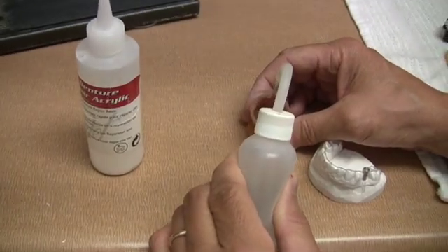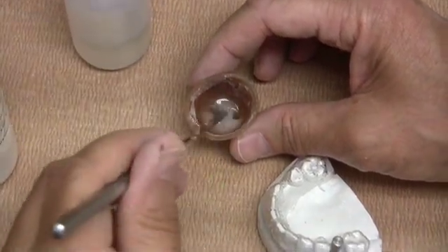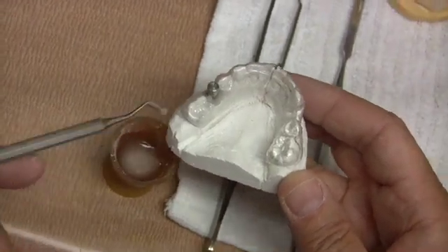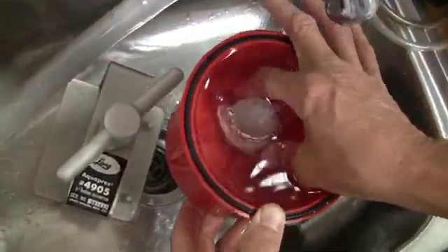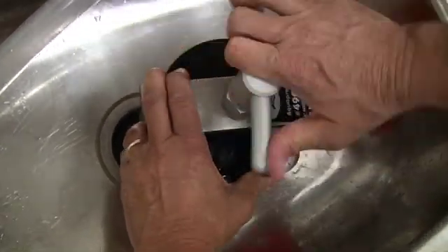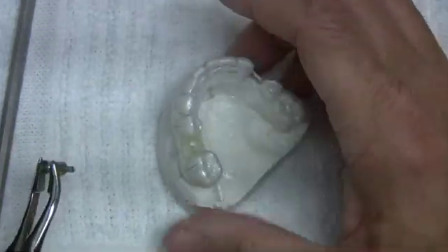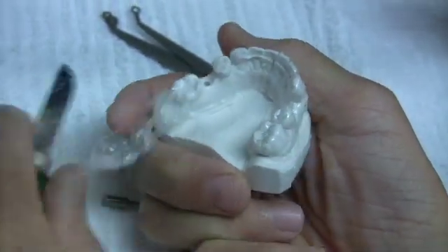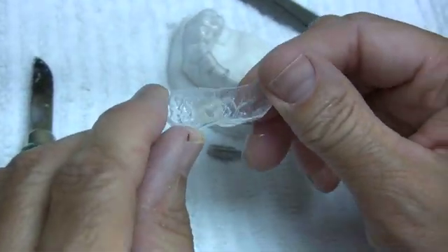Cold-cure acrylic is then mixed and flowed around the stepped pin to form the channel. The acrylic can be shaped and added to form a channel about 2 mm in thickness. The model can then be placed in a pressure pot to be cured or allowed to bench cure. By placing the model in a pressure pot, the cured acrylic will be clear and not cloudy. After 15 minutes, the model is removed from the pot, the stepped pin is removed, and the guide is separated from the model. By coating the model with separator before adding the cold-cured acrylic, it will assure easy removal of the guide.